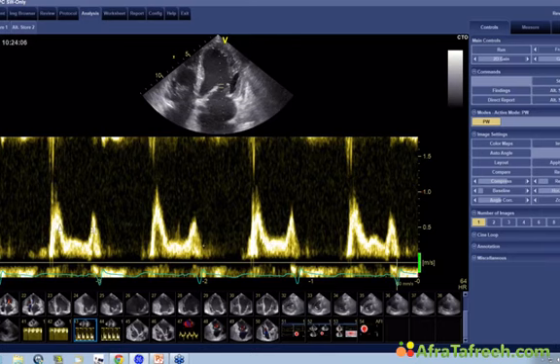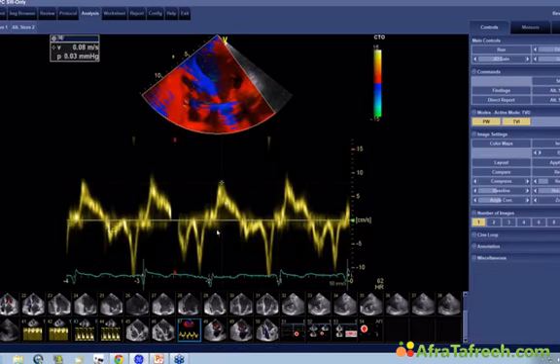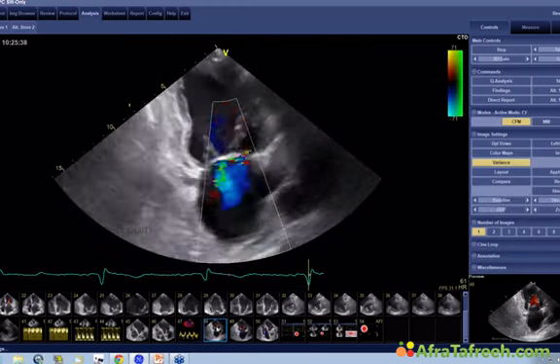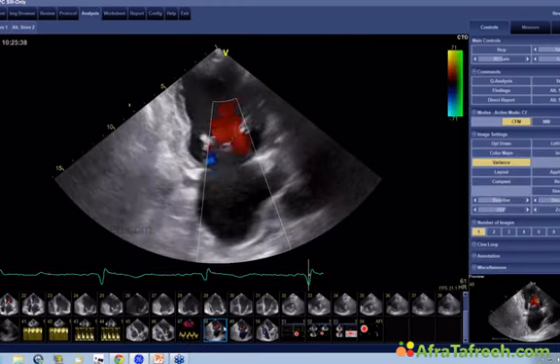And just by seeing this alone, I can tell that filling pressure must be elevated. This cannot be normal function. It cannot be normal because your patient has reduced left ventricular function in the first place. But this by itself is a sign that the patient has elevated filling pressure. And if I do the E to E prime, you measure the E prime value here, it fluctuates a bit, I kind of average it, I would get an E to E prime ratio in the range of 25 to 35, which simply means that our thoughts about left ventricle filling pressures were correct and that it is elevated.